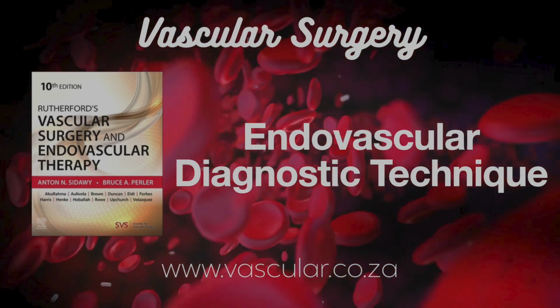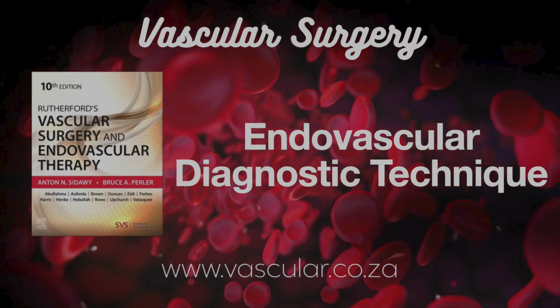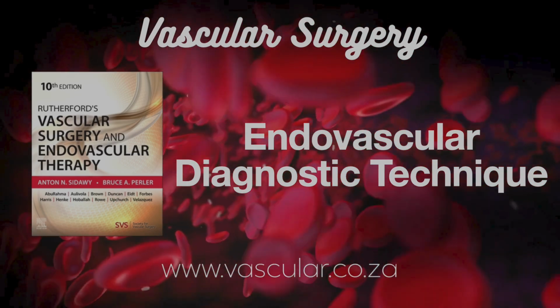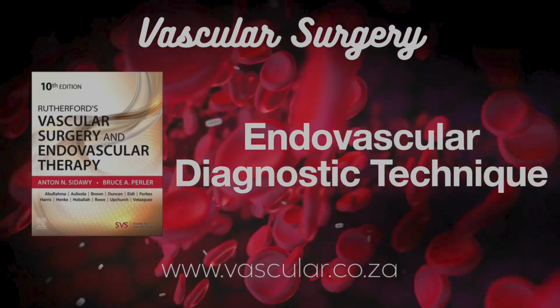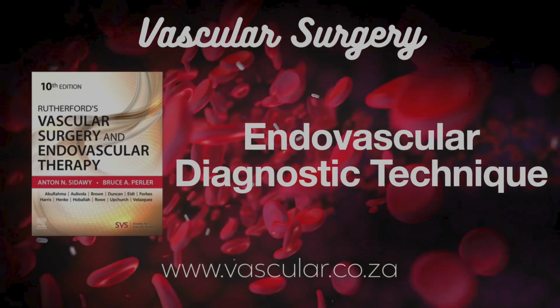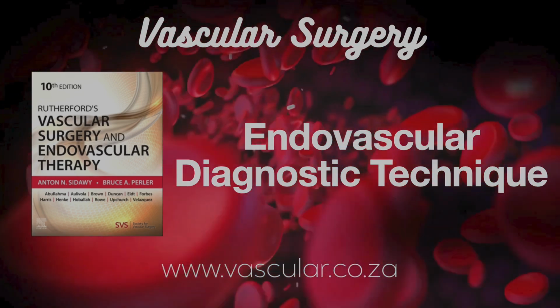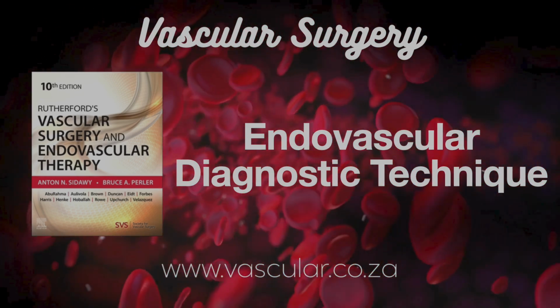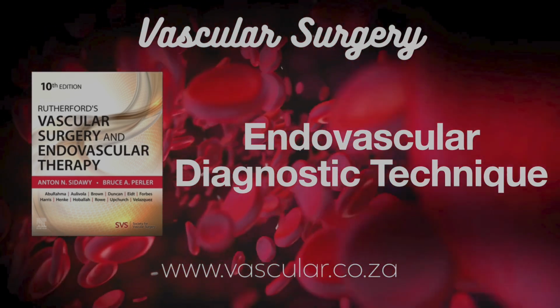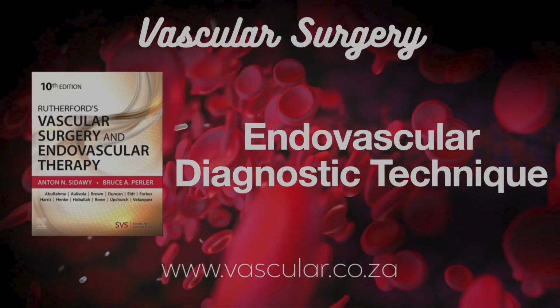But ultrasound seems like the real game changer for access. Oh, absolutely. Direct, real-time visualization of the vessel, surrounding nerves, veins, plaque, everything. Huge help in obese patients, diseased vessels, scarred groins. And the evidence supports it. Consistently. Studies show ultrasound guidance increases success rates and significantly reduces complications. You see the needle advance, indent the vessel wall, just takes the guesswork out.